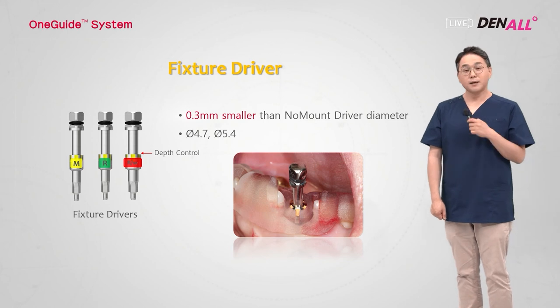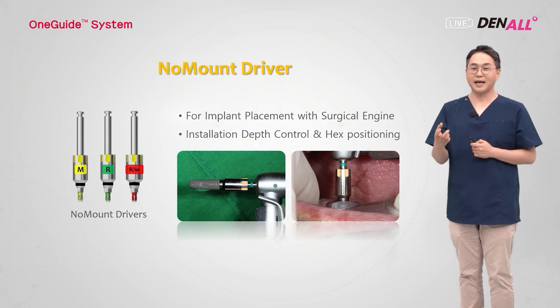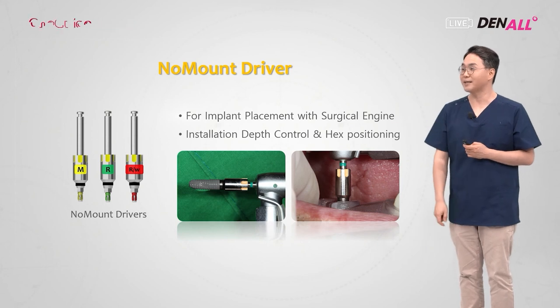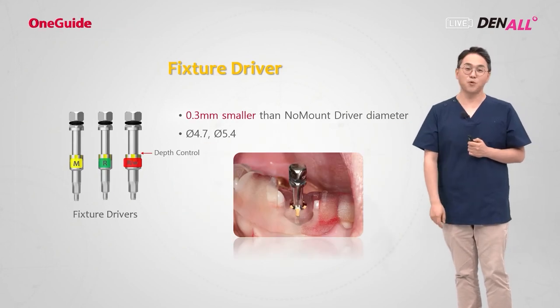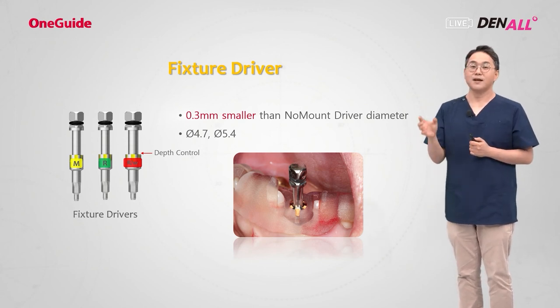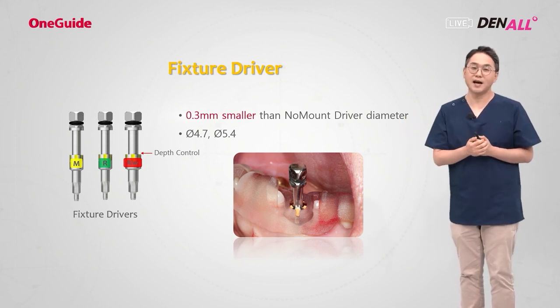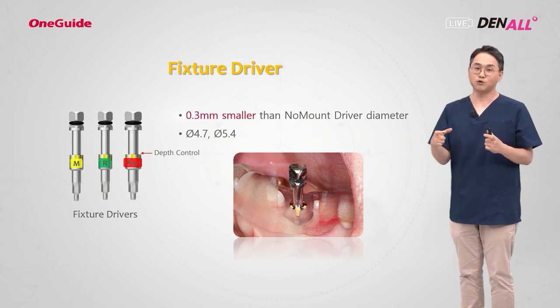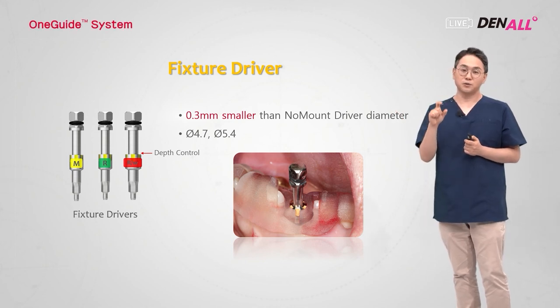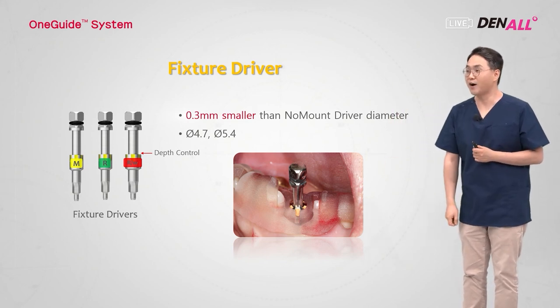Next, the fixture driver. As you can see, this looks different from the no-mounted driver. The guide length is 8 millimeters in the no-mounted driver. In the case of the fixture driver, it's 4 to 4.5 millimeters long, because when you use a fixture driver, it can jam into the guide hole. So the diameter is reduced by about 0.3 millimeters, and the guide length is reduced. To place deep enough subcrestally, the guide barrel is reduced.